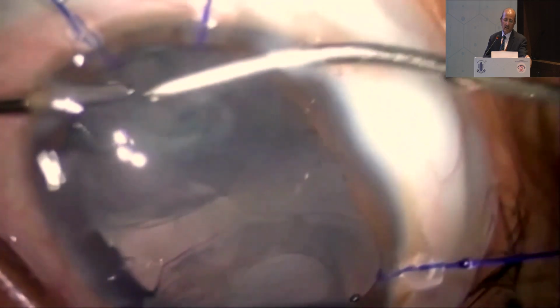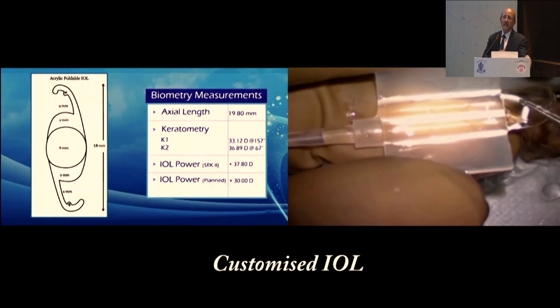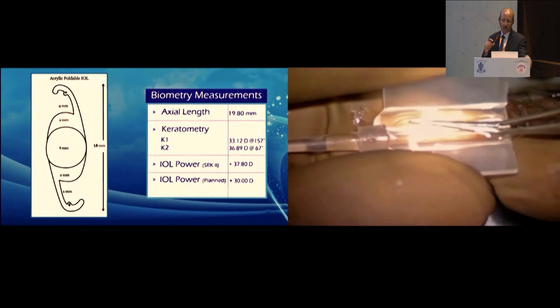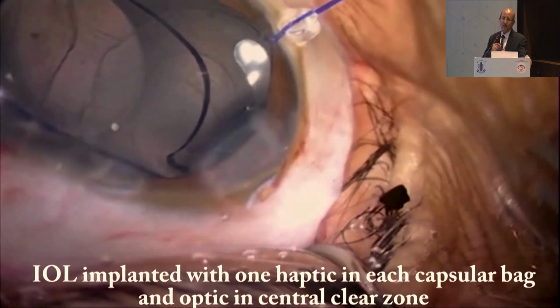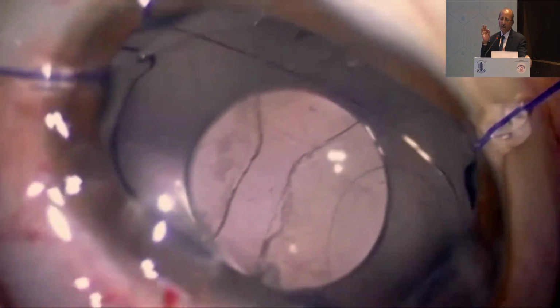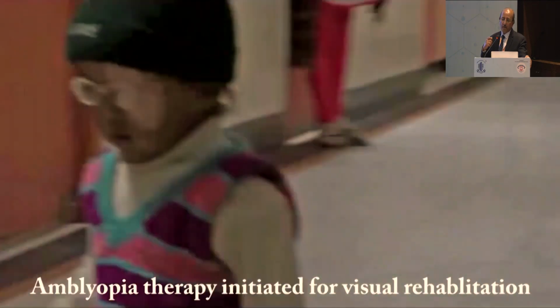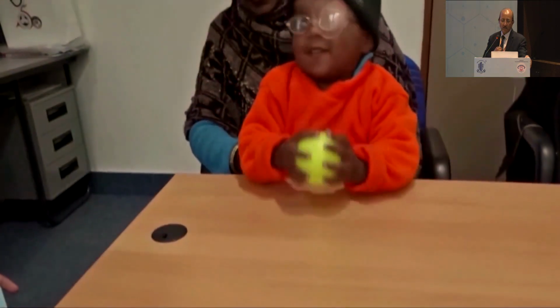And this was an 18mm long customized IOL which was made by Care Group. Actually you will find a hole in the haptic, because I thought that if I fail to place the IOL, then I will do transscleral fixation of the IOL. The second choice was also kept.